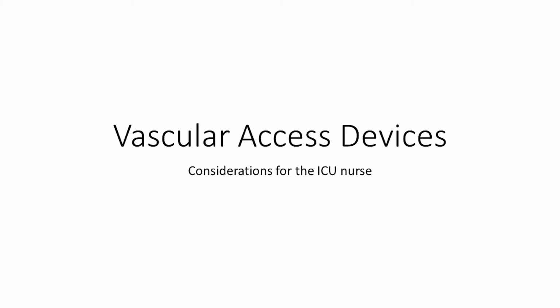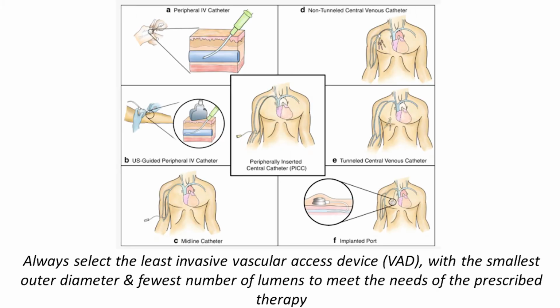Vascular access devices, considerations for the ICU nurse. There are many options available when vascular access is needed for your patient. When considering what is right for your patient, you should always select the least invasive vascular access device with the smallest outer diameter and fewest number of lumens to meet the patient's needs of the prescribed therapy.